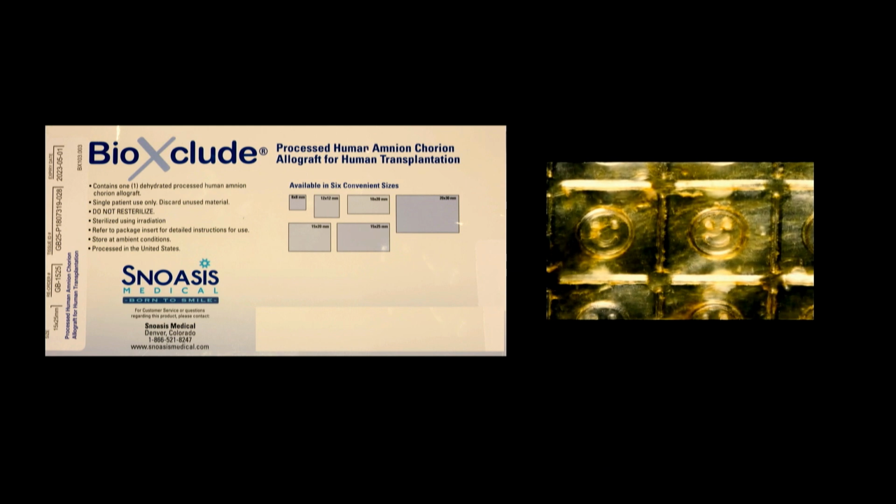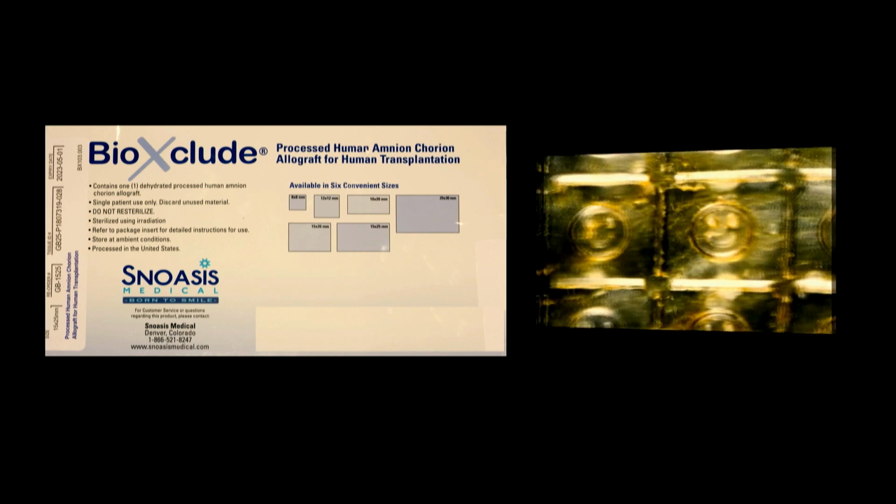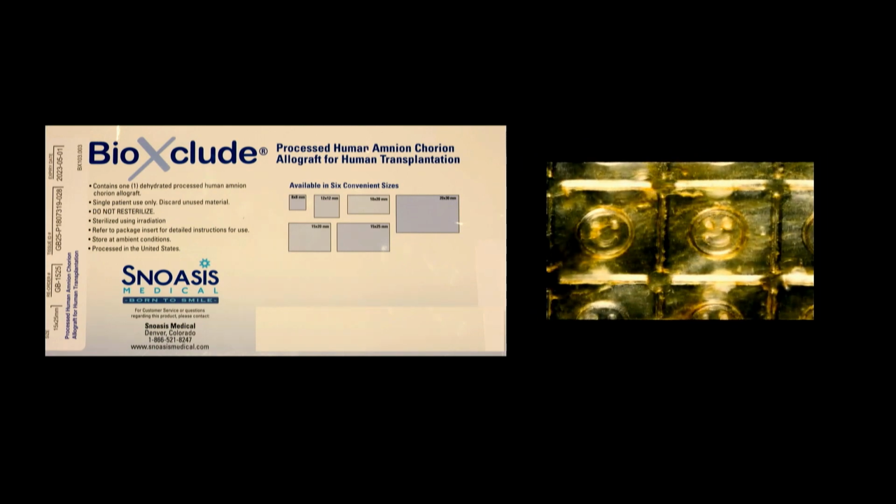If you're familiar with the packaging here, BioXclude, I love the sense of humor. They put the little smiley face on there. The reason for that is so we know that this membrane can be used either right side up or right side down. It doesn't matter. They're both the same, and you can see that membrane can go either way. So there's no upside or downside.